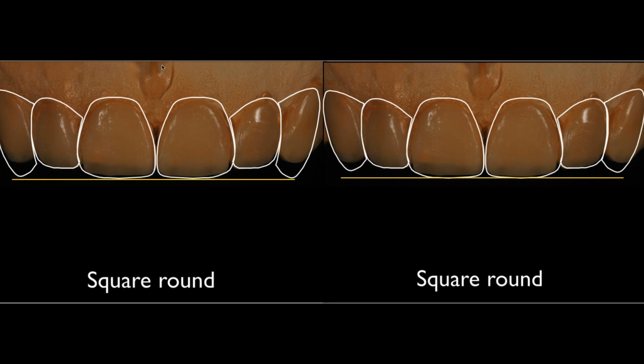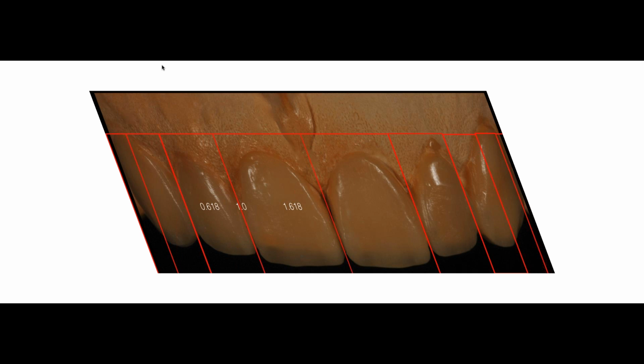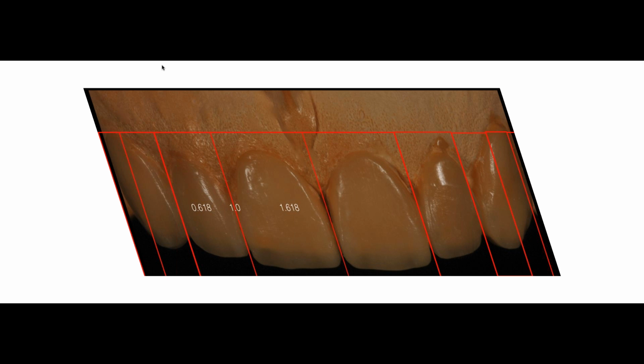So this is definitely a face-related treatment plan. We're looking at the facial aspect of the patient, and we're taking that all the way down to her 6 anterior teeth and 2 bicuspids if needed, to analyze how much I have to deliver dentistry-wise in order to achieve a great improvement in her smile, and at the same time communicate with the patient.